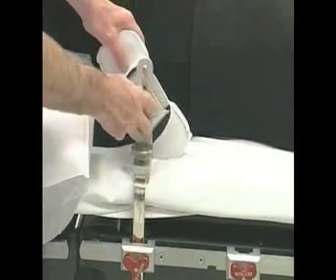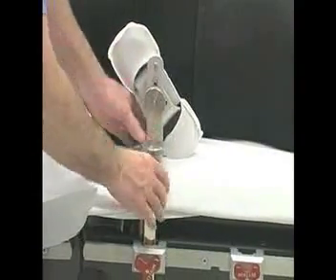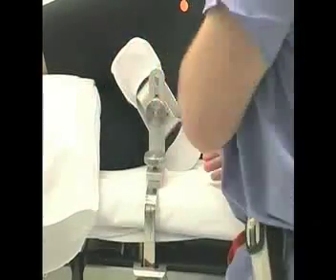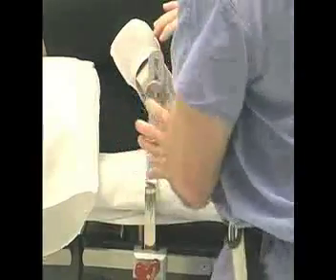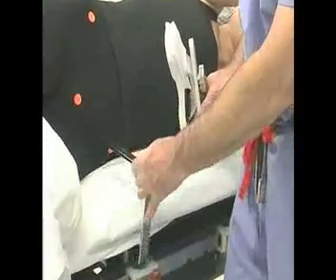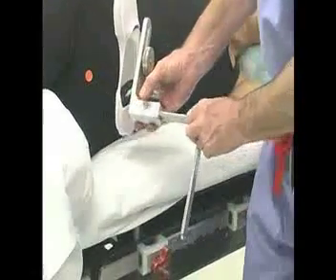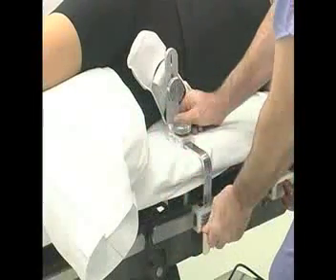Choose the anterior pelvis support that best centers the pads over the downside anterior superior spine and the symphysis pubis. Place the support onto the anterior pelvis upright with the guide pin up and in the slot to control the angle of the support and allow the proper excursion of the anterior pelvis support in the anterior pelvis upright. Place the thumb nut and lightly tighten to hold the anterior pelvis support to the upright and lock the angle.